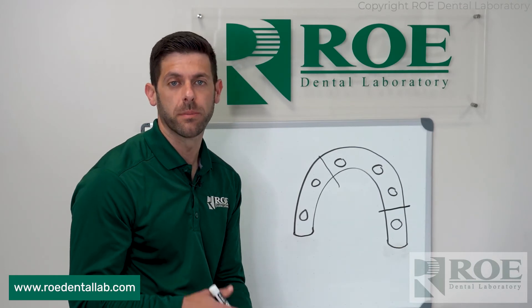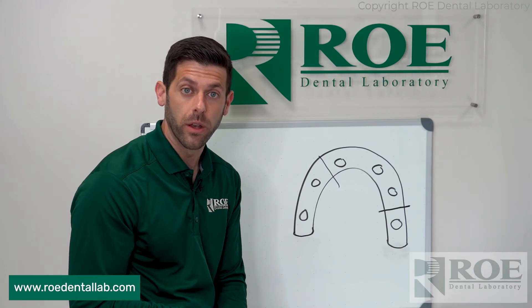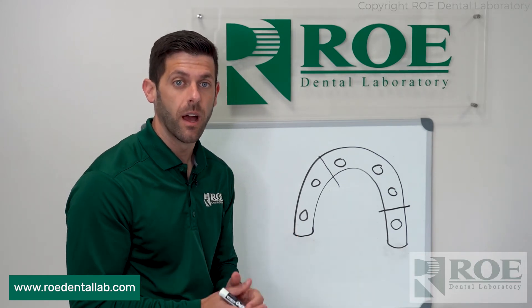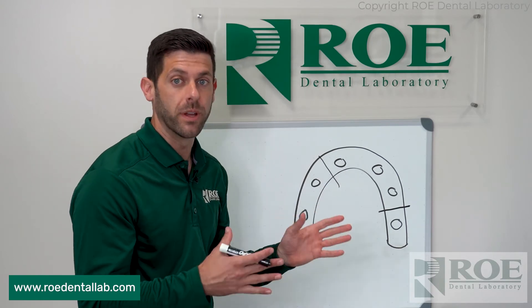You can use some acrylic — we recommend Stellar. BoCo is another good one, or GC Pattern Resin. We just want to make sure that we lute it together so it's not going to move in shipping.